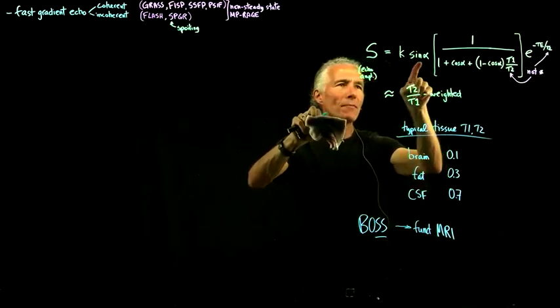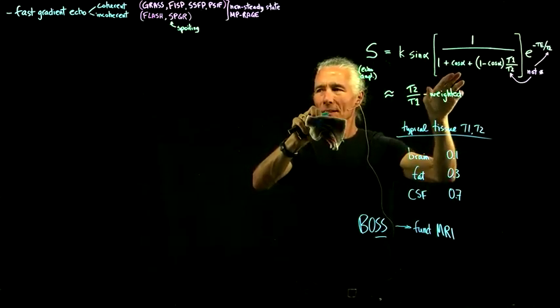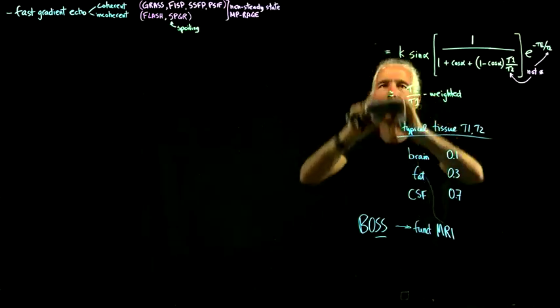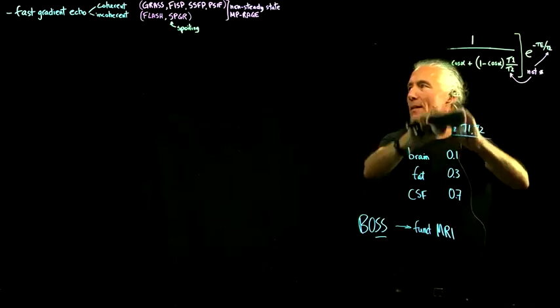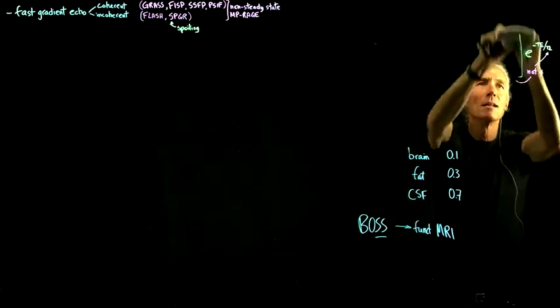And if you put a 90 into the equation over here, it will still work. You'll still get a signal. Whereas if you put a 90 into the equation for the incoherent one, you pretty much won't get a signal at all.